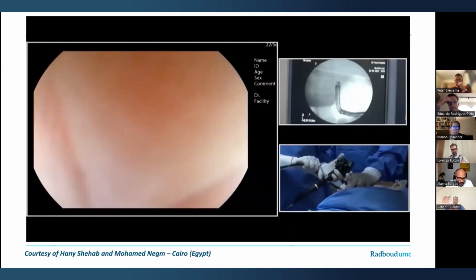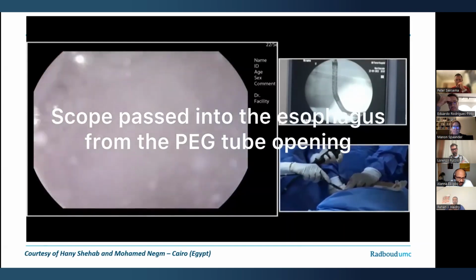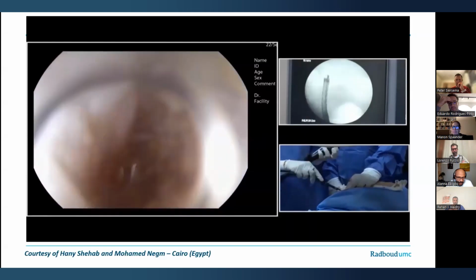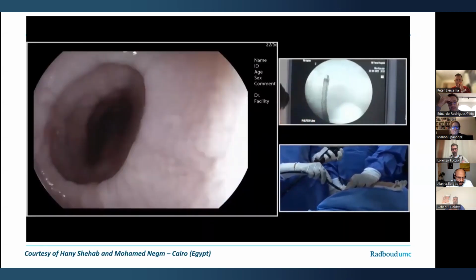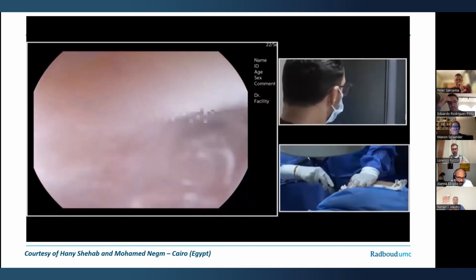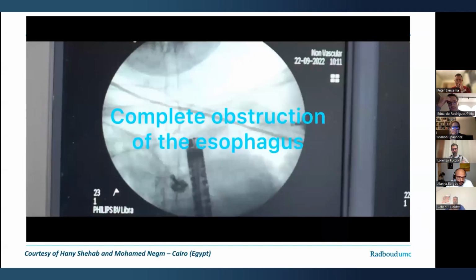Can you have a look at the screen? Should have used the cap. So you can see now on the screen that we're moving upwards. I think you can do without the cap. Yeah, this is the first step.